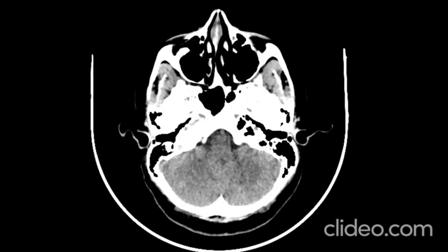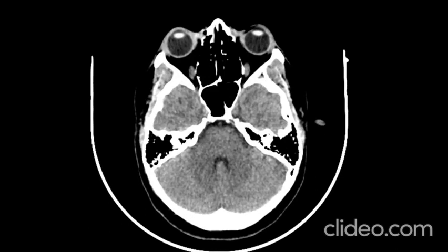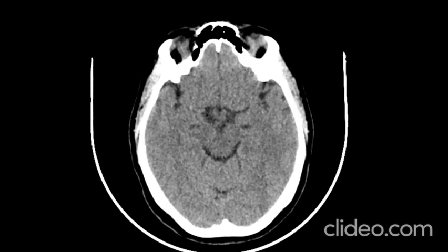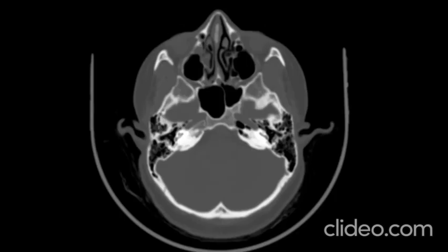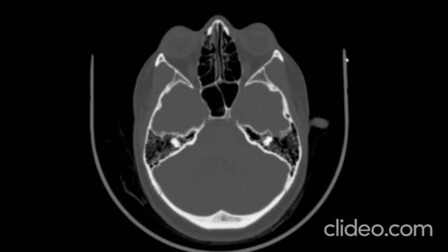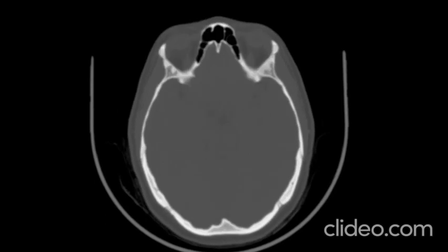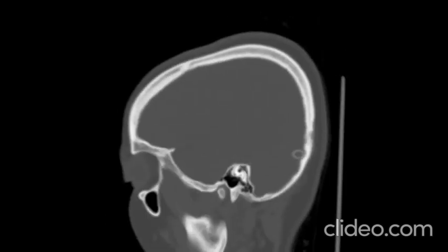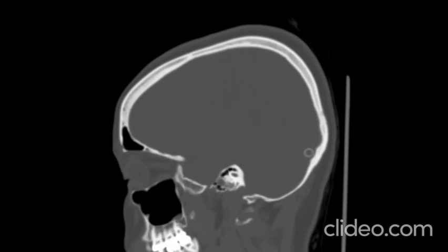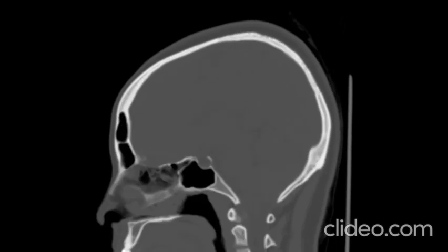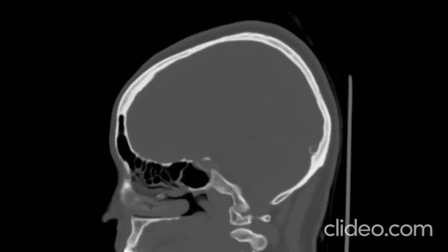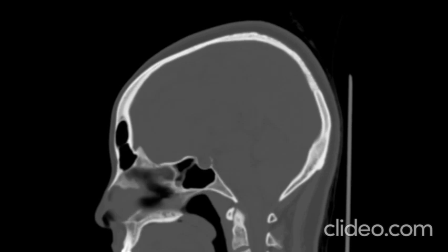Non-contrast axial CT scan shows a fully expanded, well-positioned stent in the right transverse sinus with no parenchymal abnormalities. Axial and sagittal CT scans with bone windows confirm good positioning of the stent within the right transverse sinus and no other abnormalities.